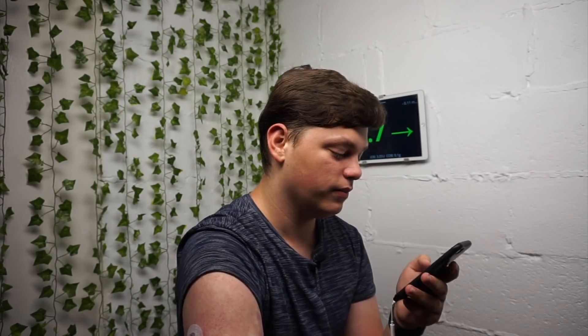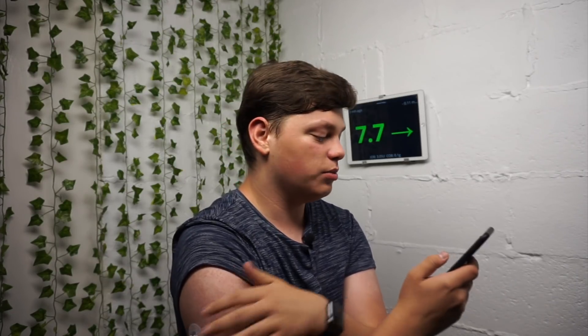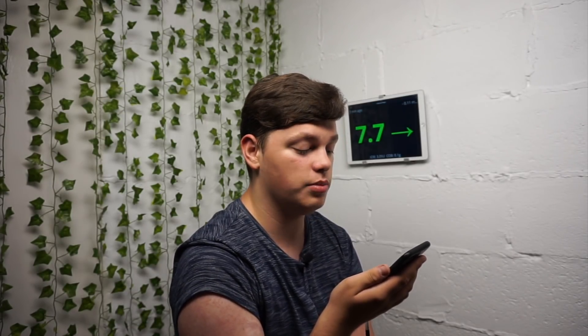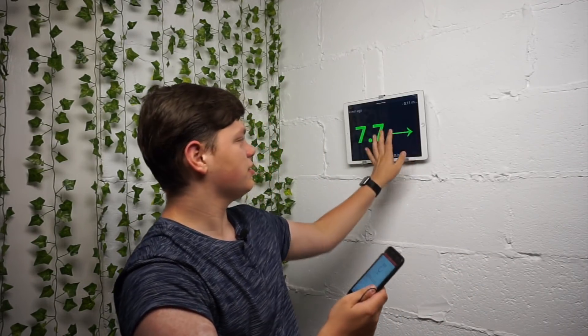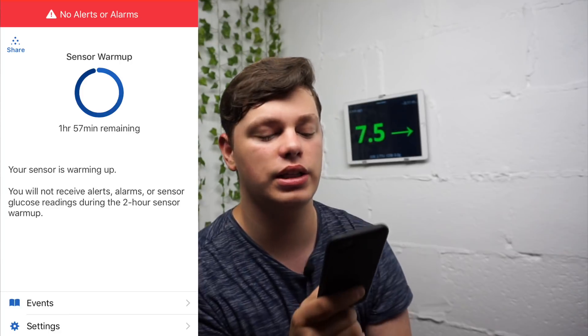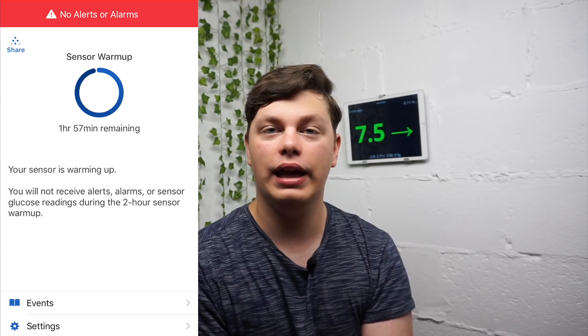Have you inserted the sensor? Yes, I have. Now with the Dexcom G6 you do actually have to wait two hours — the sensor activation warm-up is two hours. It says 'Keep your smart device within six metres of the transmitter, pairing may take up to 30 minutes.' About five minutes after recording, it said 'Start a new sensor.' I pressed start and now it just says 'Sensor warm-up: 1 hour 57 minutes remaining.' So I have to wait two hours to get my first reading. That's my life with glucose level 7.7.